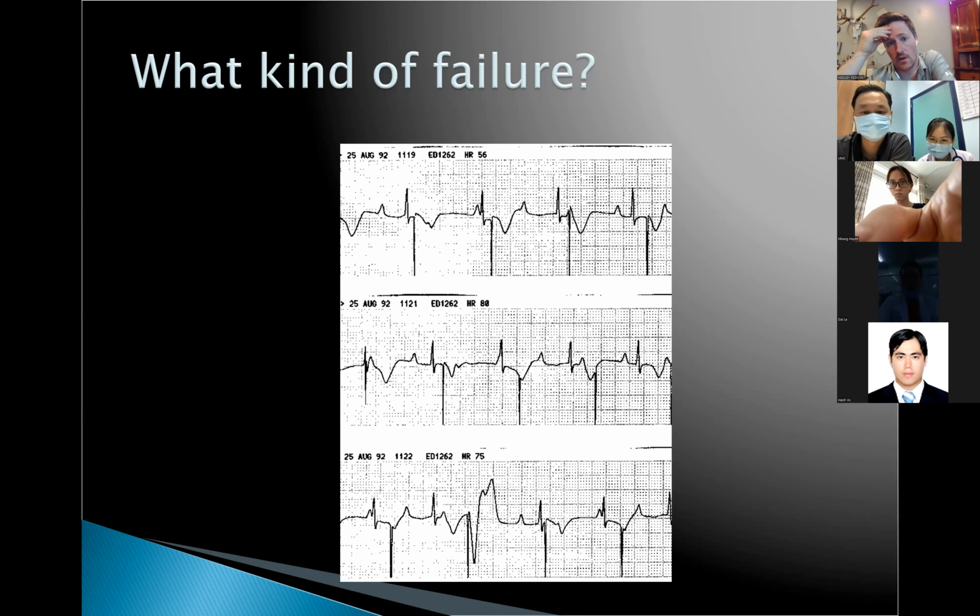And the pacer spikes are kind of appearing in that T wave. When they shouldn't be in the T wave, they should be sensing that beat and should be later, because that's a refractory period of the patient. So we see these non-conducted pacing spikes during the refractory period. So that's where that arrow is pointing to. That's a non-conducted. But there's one pacer that occurs outside of the refractory period and it's conducted, and that's the very bottom one. So that on the very bottom and then the third beat is a conducted beat. Okay? Does that make sense?